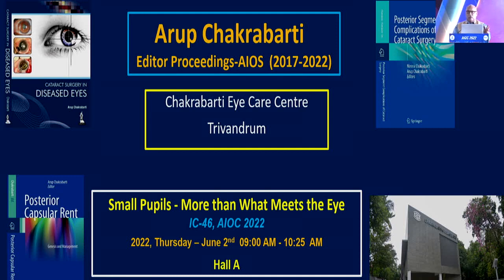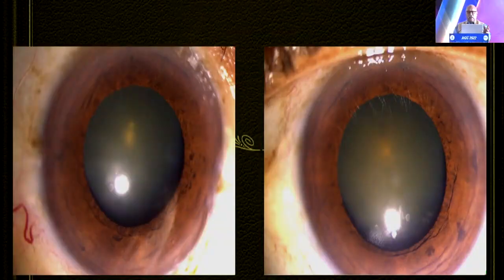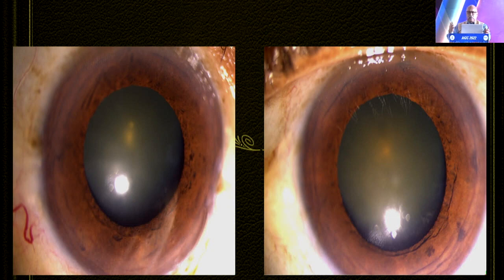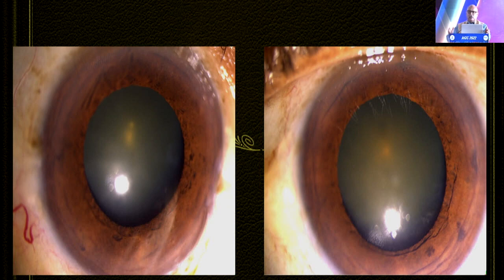I will be showing you a video of a patient who was an IFIS candidate — an elderly man on alpha-1 antagonist, a hypertensive guy on benzodiazepines. If you see the pupil, it also doesn't dilate well; this is the maximal mydriasis. The literature mentions that any pupil which does not dilate beyond 6.5, 7, or 8 millimetres could be considered an IFIS candidate.